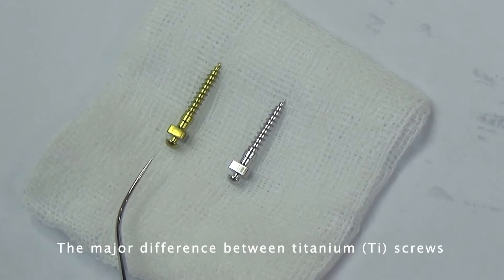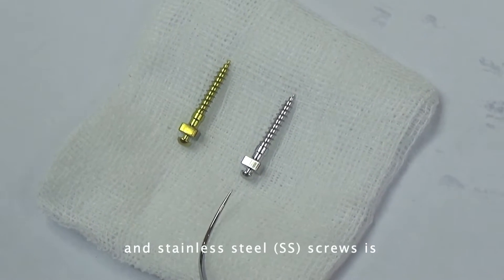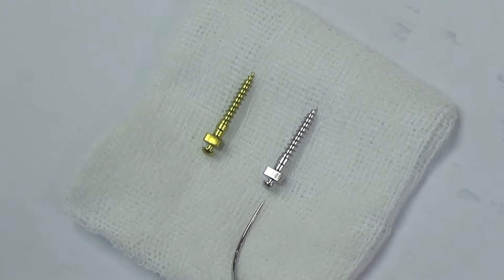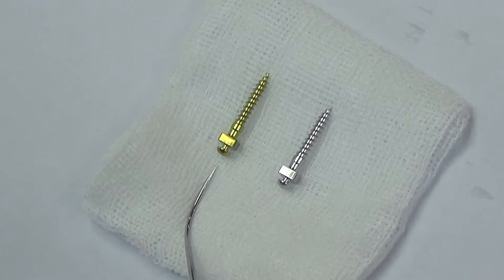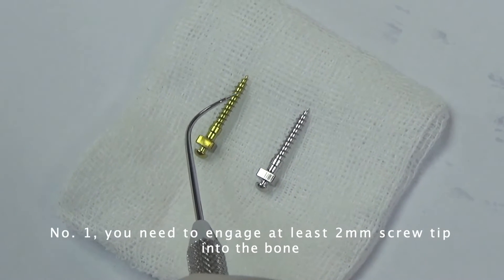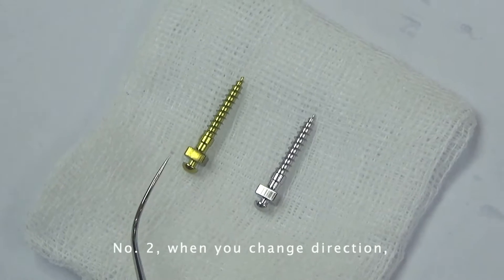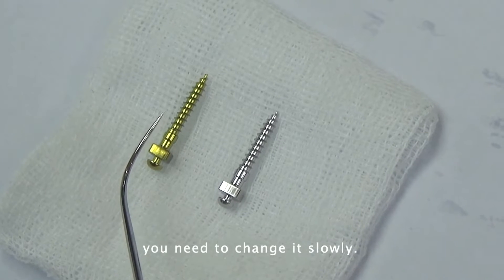The major difference between titanium and stainless steel screws is that the stainless steel screw has more flexibility. So when you insert the titanium screw, make sure: number one, you need to engage at least two millimeters of the screw tip into the bone before you can change the direction. Number two, when you change the direction, you need to change slowly.